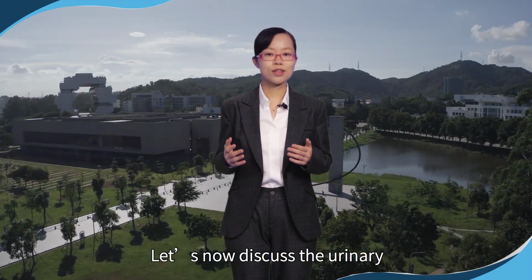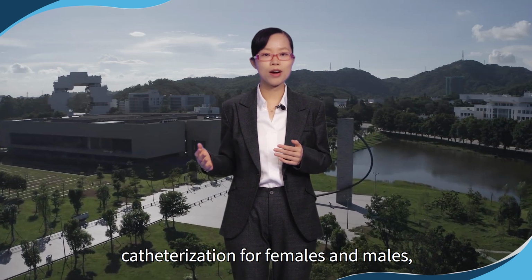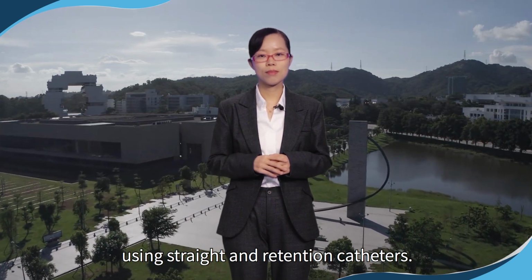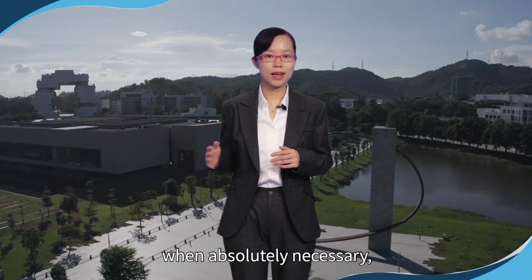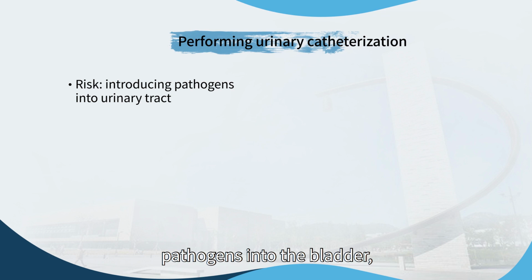Let's now discuss the urinary catheterization for females and males using straight and retention catheters. Remember, this is usually performed only when absolutely necessary, because of the risk of introducing pathogens into the bladder, ureters, and kidneys.